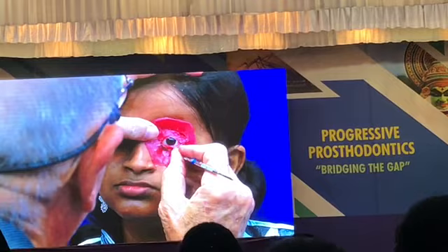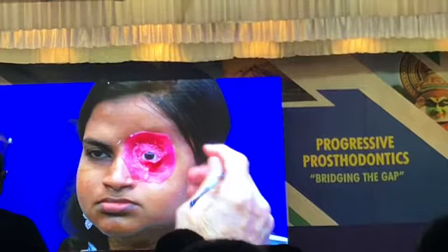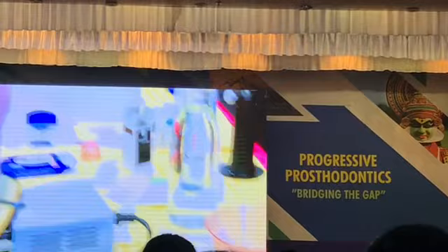Now the problem with this defect is that there's not enough depth on the medial side here. Switch over to the other one.